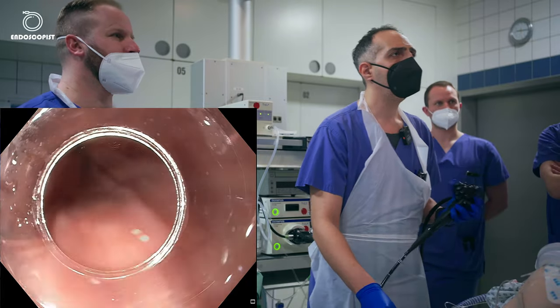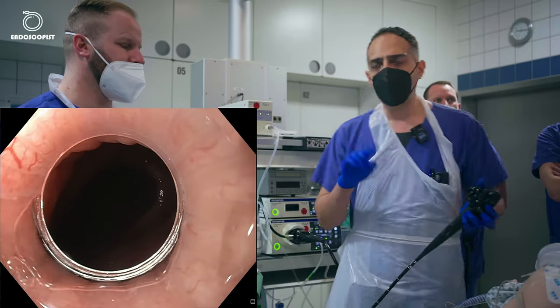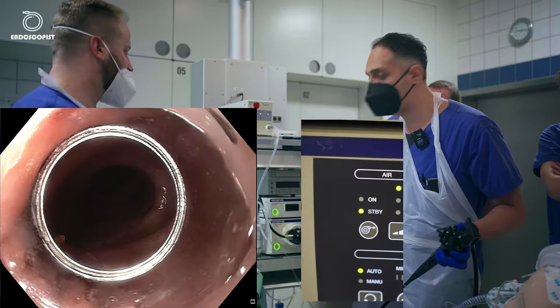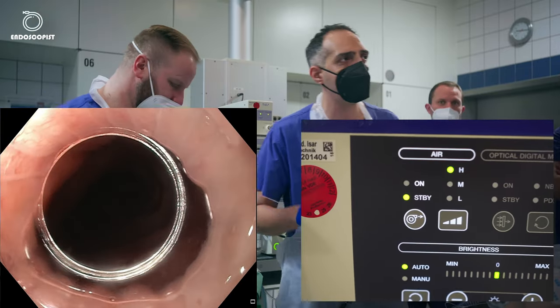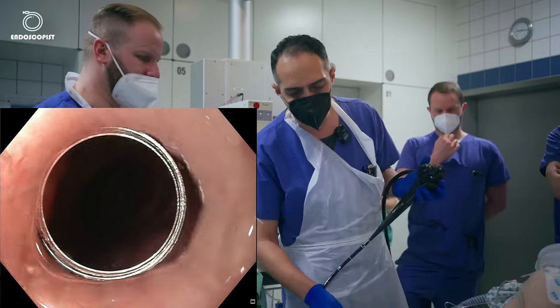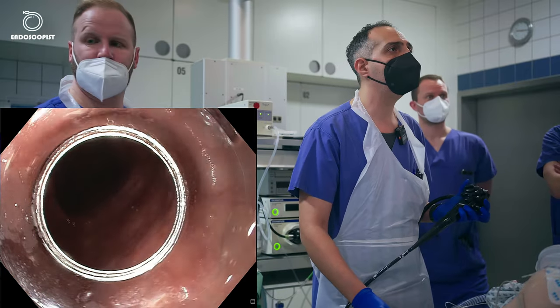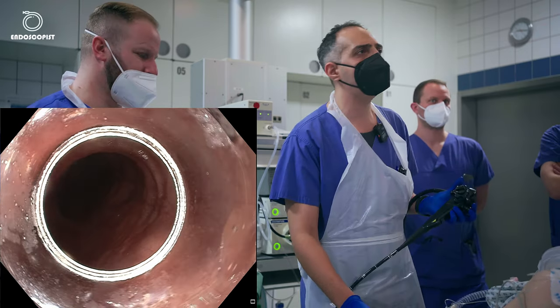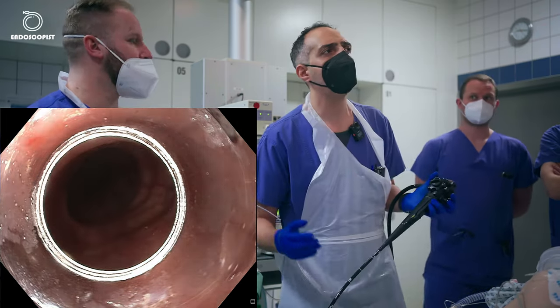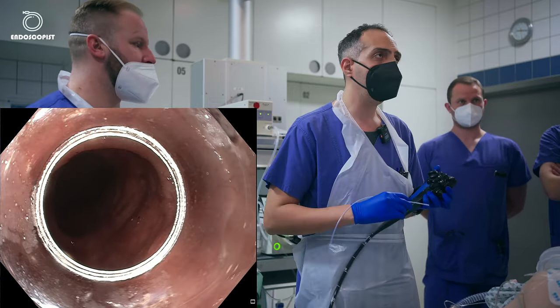Okay, we are fine. Before we start, I have every time to check that the air is standby, because you are not allowed to give air in the mediastinum because you have a high risk of air embolism, which can be fatal. And let's start, as we said, here. Okay, I will start by 25 centimeters. That means we will do something like 17 centimeters tunnel. We'll start with the needle.